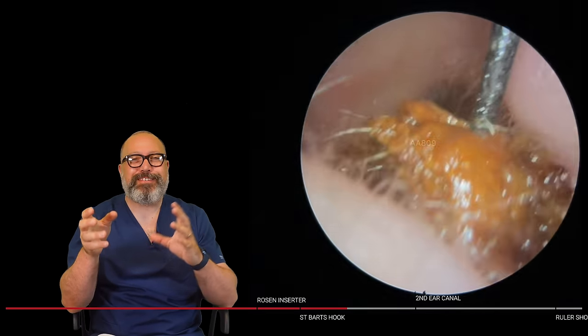Now you can see the sort of flecked marks on the eardrum there. That's one where the wax was right up against the drum. So when I say that ear canal was chock-a-block, it was literally full from front to back. That plug went all the way down to the eardrum. So you can see just how much difficulty this patient would have been having.